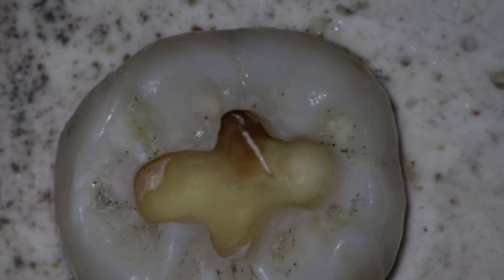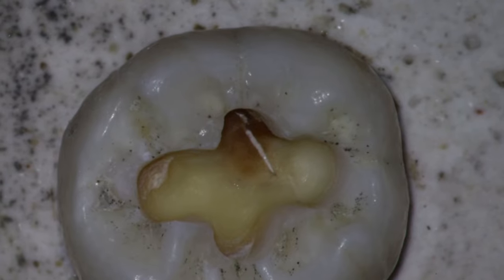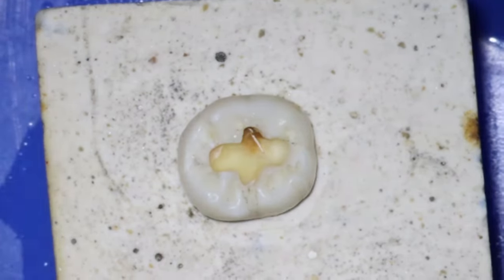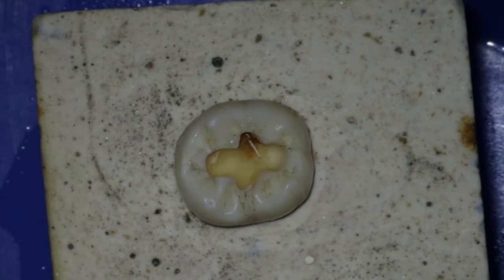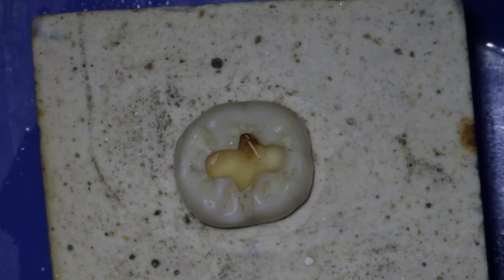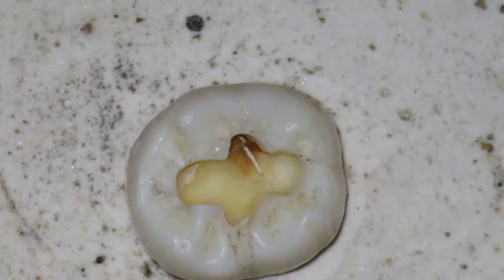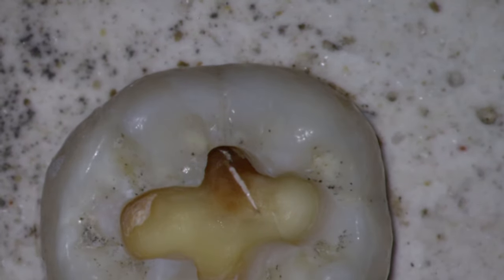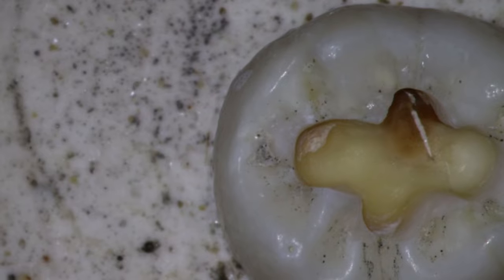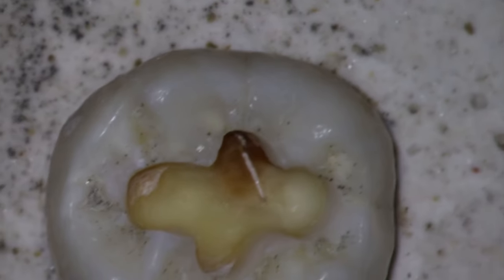So once your etchant application is done and you wash it, then you have to bond. And right now I have the fifth generation bonding agent from 3M. This fifth generation means it only has primer and adhesive in it, but you will have to have the etchant separately. So now this has to be applied both for enamel and dentine.